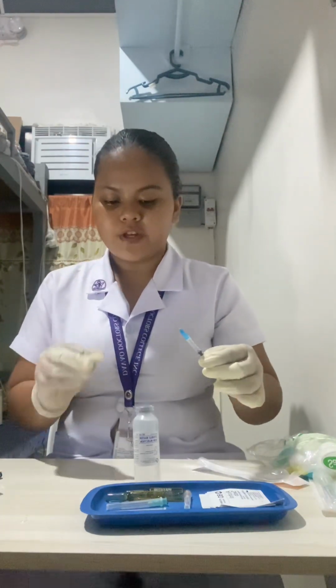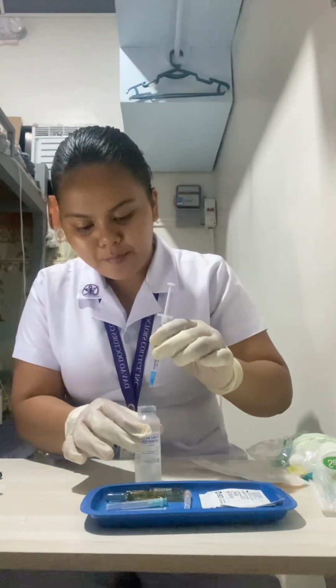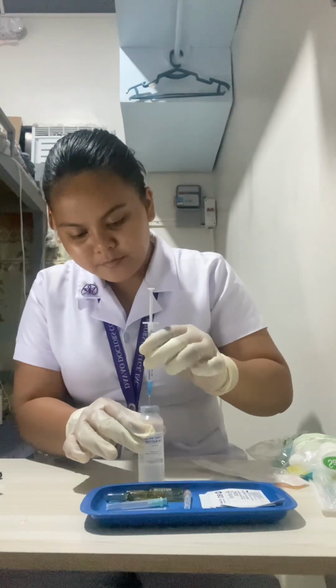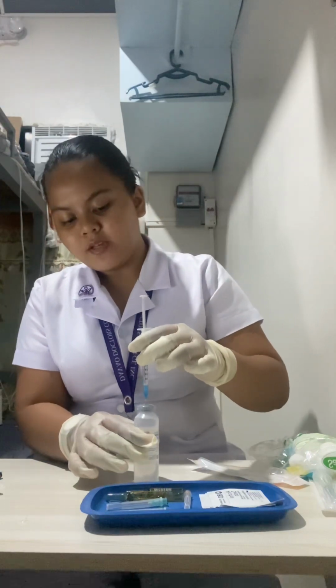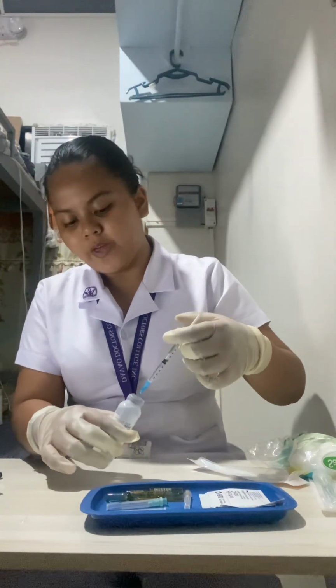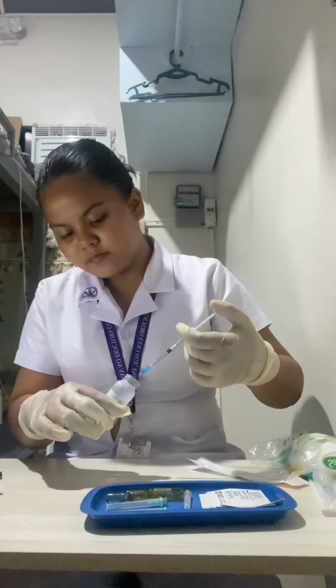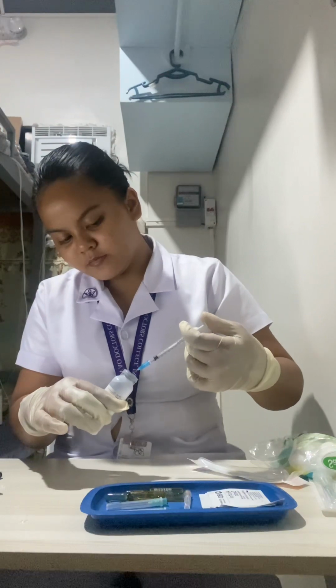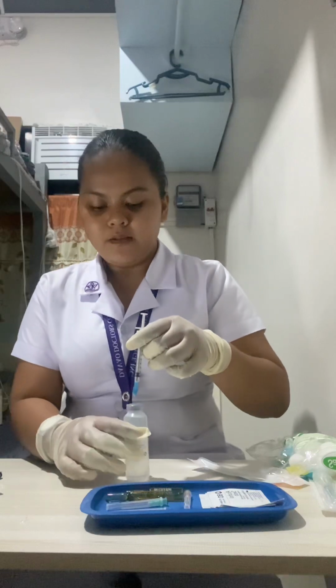Then after drawing air into the syringe, I'm now going to inject it through the rubber cap of the vial carefully, making sure that the bevel of the needle does not touch the fluid surface, or is above the surface, because injecting air into the vial helps prevent the creation of bubbles. So now I'm going to inject the air. After injecting the air into the vial, I am now going to withdraw the medication.